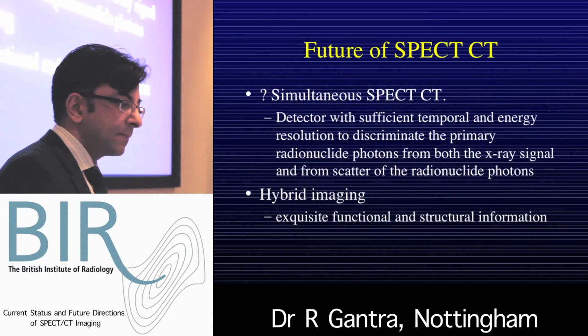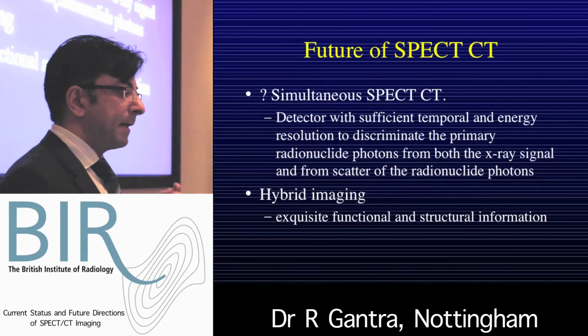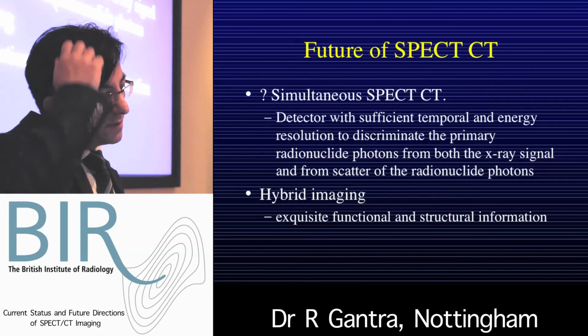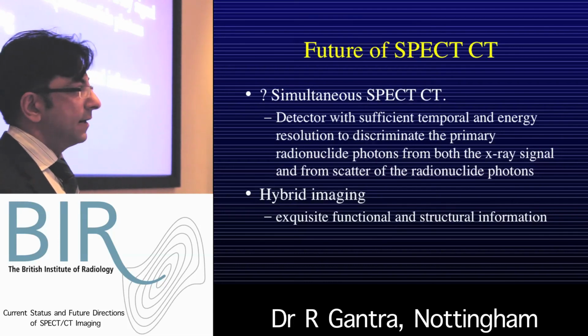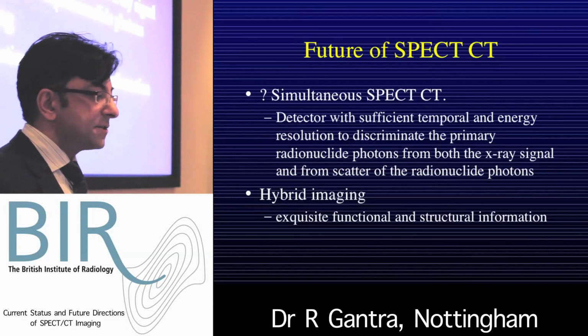So just to finish off, what about the future of SPECT CT? I think what needs to happen is an improvement in detector technology, where we have detectors with sufficient temporal and energy resolution to discriminate between the primary radionuclide photon, the X-ray signal, and also account for the scatter from the photon. Only then I think we're going to get true registration.